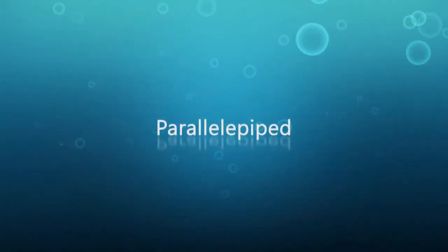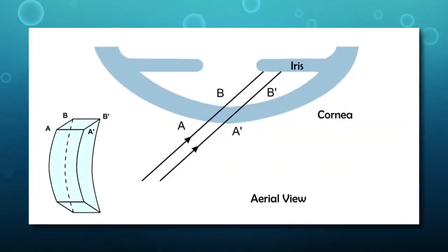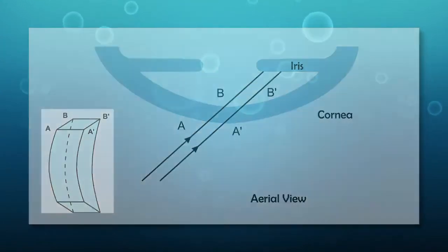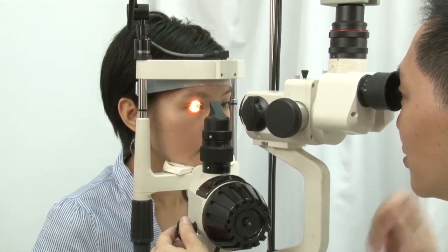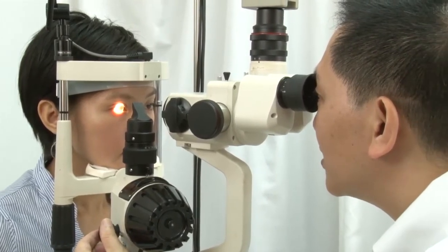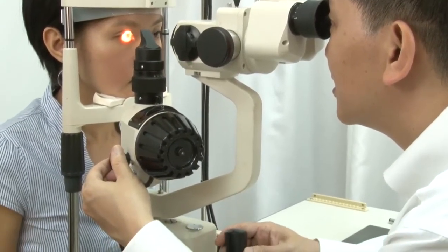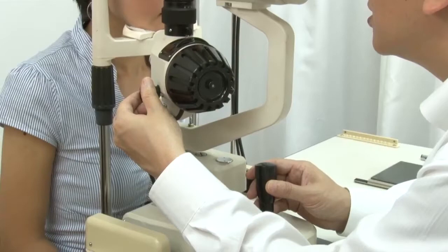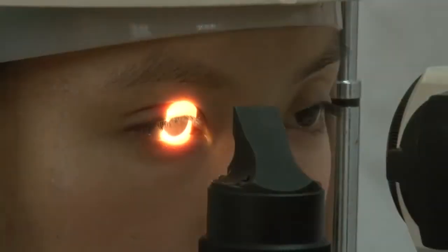Parallelepiped. This examination technique requires narrowing the wide slit beam to about 1 to 2 millimeters. It is useful for a general survey of the corneal layers, for example, epithelium, stroma, endothelium, as well as viewing scars, abrasions, and corneal nerves. To perform this technique, maintain the angle between light source and microscope at about 45 to 60 degrees. Change the diffuse illumination to a parallelepiped by narrowing the slit lamp beam to about 1 to 2 millimeters.